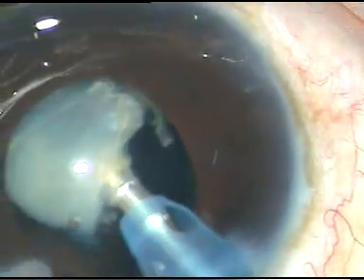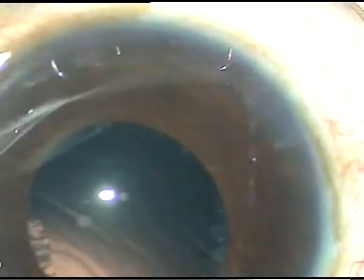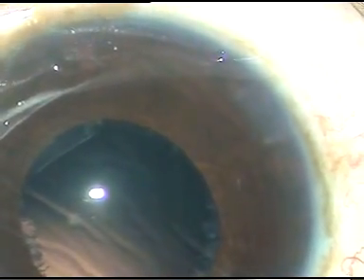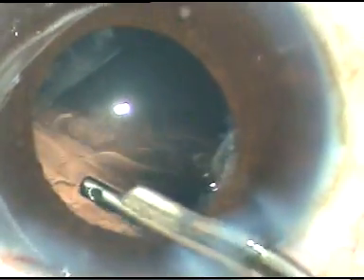It has to give in at the last moment. So instead of trying to separate the posterior plate with two instruments, this is another technique: we just trim the peripheral portion, keeping the central part of the plate intact, and at the end the central plate tilts, sometimes tumbles, and you can easily remove it.